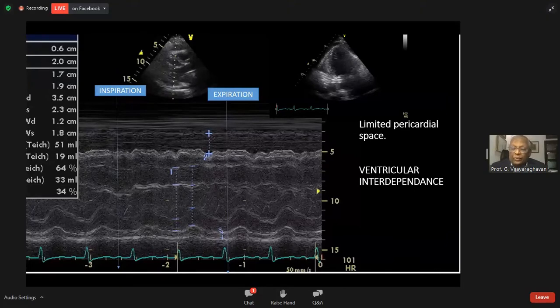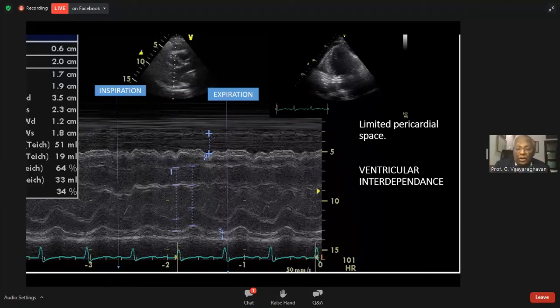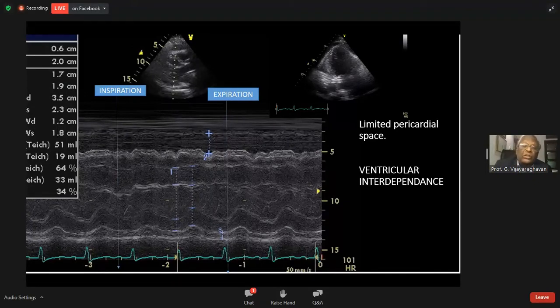In restrictive cardiomyopathy, these variables are, to some extent, normal — but always ten percent or less. In constrictive pericarditis, they are far more than ten percent, and this could be diagnostic. These are the first things to understand.